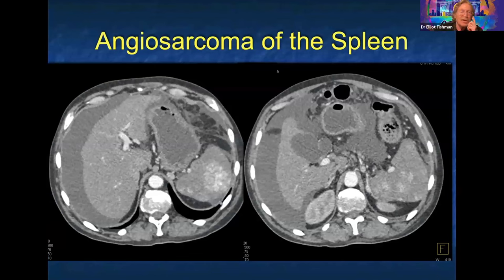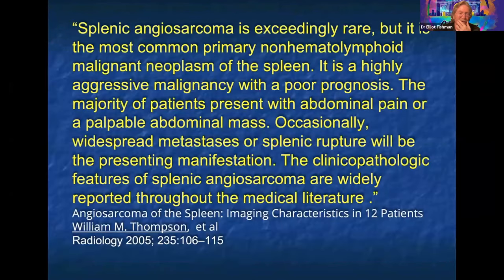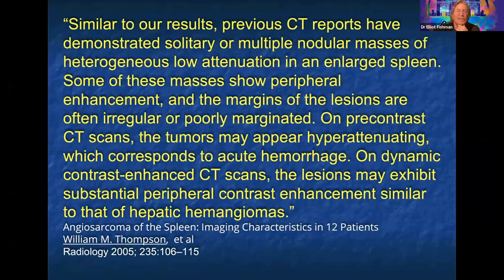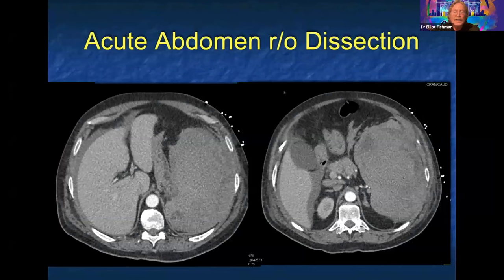Someone suggested angiosarcoma — very good. Believe it or not, we've had three cases of angiosarcoma in the last four or five months; they're exceedingly rare. They can cause splenic rupture. There's one article with 12 cases in Radiology. The lesions may exhibit substantial enhancement and you can think about hemangioma, but the pattern doesn't really look like hemangioma — hemangiomas are better defined.